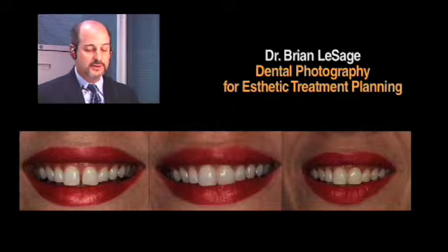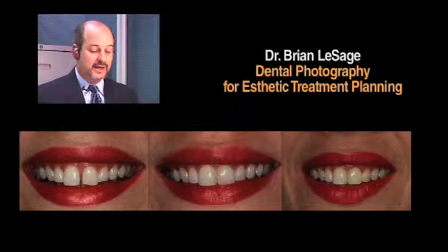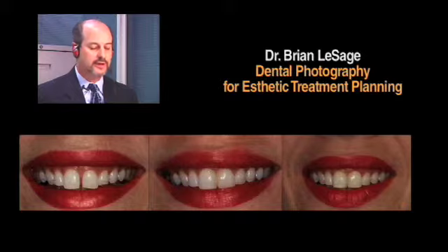So we developed this film in this case, all right? And so I knew when the patient came back that I had an axial inclination problem. And I think most of you would agree that if you spent an hour and a half staring at these two teeth, you'd be quite pleased with this result. And I would be surprised, I'm sure there are some in the group that have very keen eyes, but it would be hard to pick up this axial inclination problem just looking quickly. And so it is really with photography that they were able to see this issue.